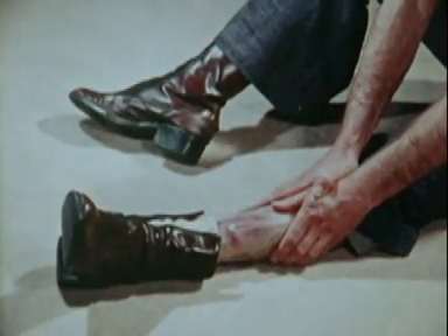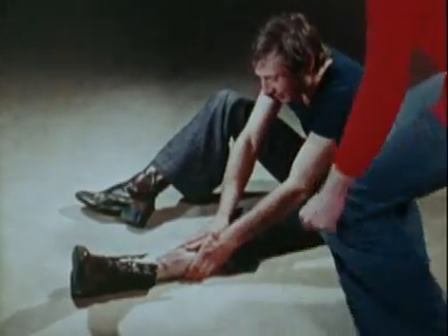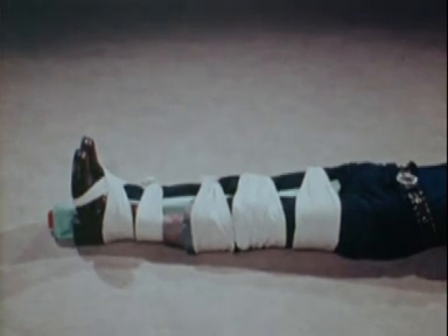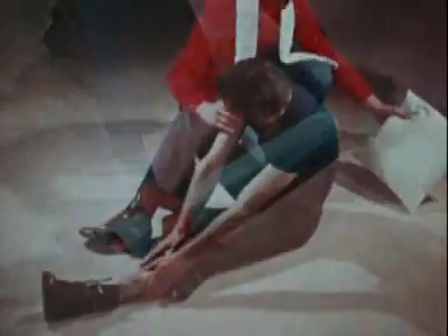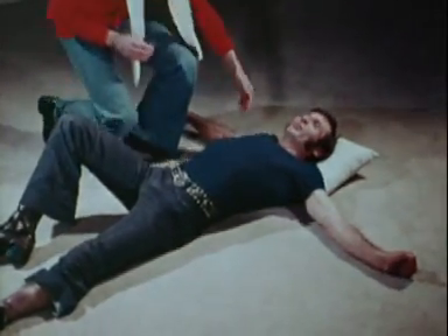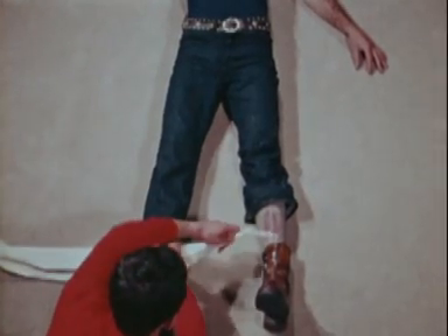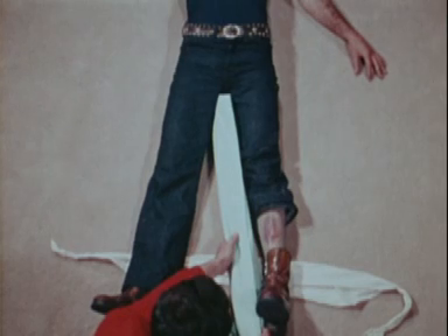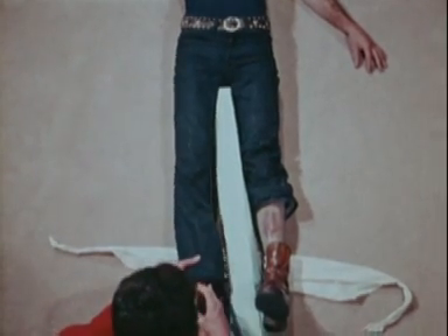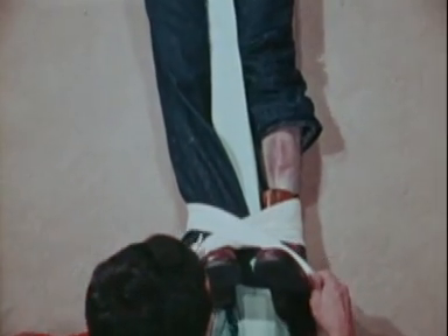A closed fracture of the tibia, fibula or both can easily be located by the swelling, which is always very visible. The whole lower limb must be immobilized. Prepare a well padded splint extending from the foot to the crutch while the patient is being placed on his back, and a wide bandage is being carefully slipped under his ankles. Place the padded splint between his legs alongside the injured limb, carefully bring his uninjured limb into alignment with the injured one, and hold the splint in place with the bandage already prepared, tying it in figure of eight fashion round his ankles and feet.